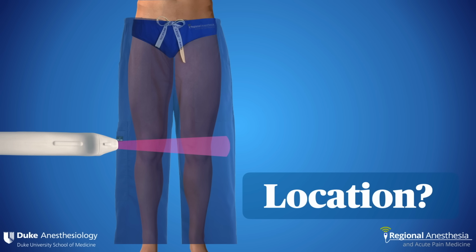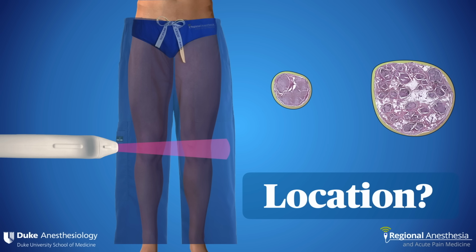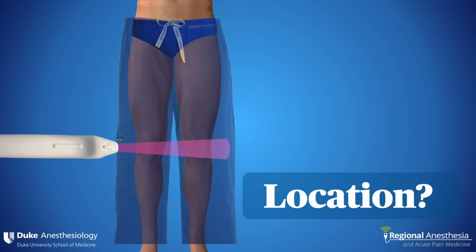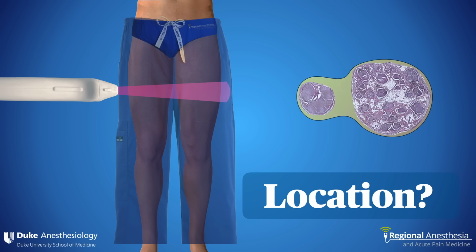Conversely, this distal location finds both branches quite separate, and each branch now has its own perineural sheath. Local placed between them would not diffuse well across the sheath, and you'd end up with a slow, poor block. You want to be here, right as the nerves are separating, but before the sheath has split apart. This gives you a nice, safe, intra-sheath target to aim for.